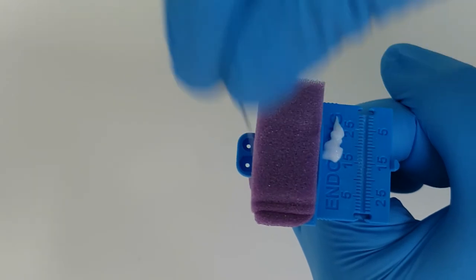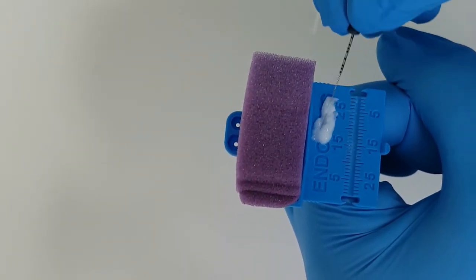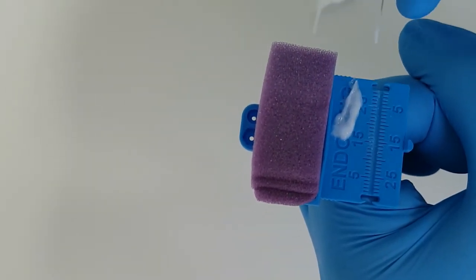This saves so much hassle and time. And finally, when you're using an endo ring with a sponge, instead of getting your nurse to put the glide paste or calcium hydroxide on a pad, ask them to put it on the edge of your ring so you can just coat your files with the glide straight away without having to ask your nurse for the pad.